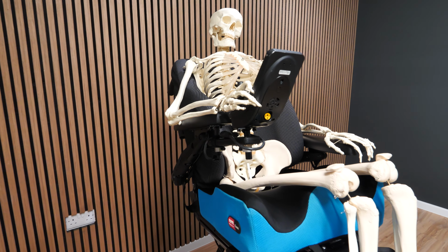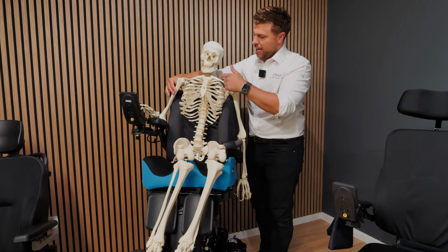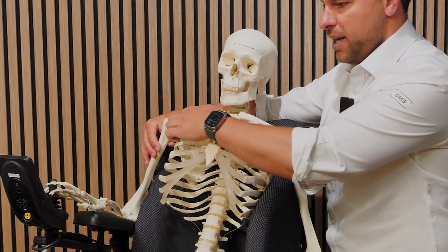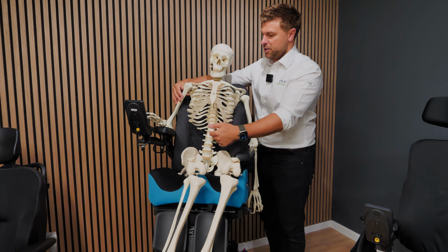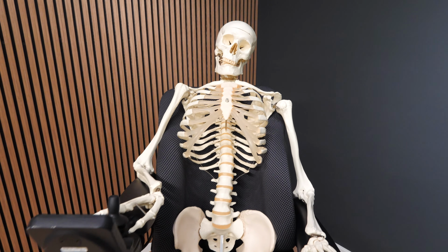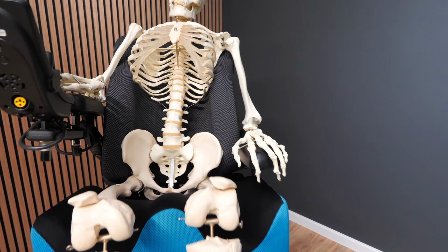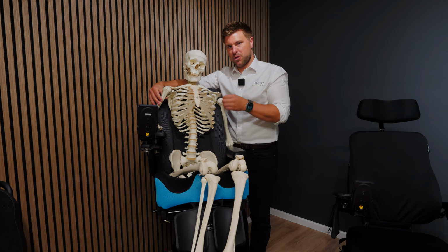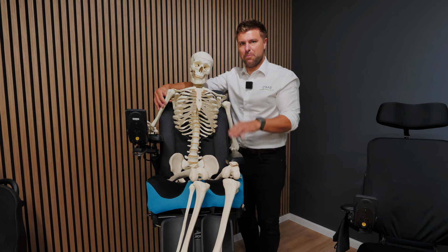With Sid's arm rested on the armrest and potentially on the controller, what you'll see very evidently is that his shoulder is raised quite high, and that naturally has an effect on the overall position of his head and also his pelvis, so it's forcing him away. The head and the shoulders are big weights for us, so if we're not supporting them correctly, then it has a massive knock-on effect with overall posture maintenance.